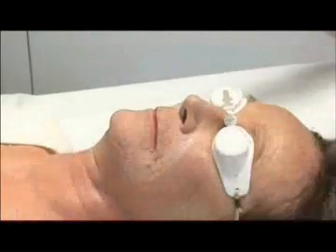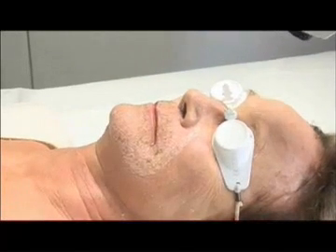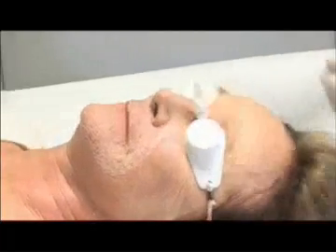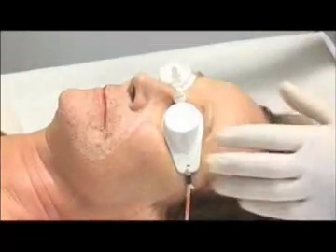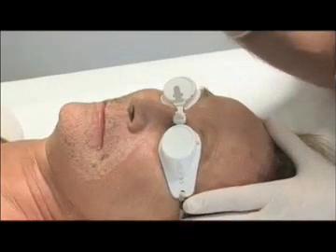Voilà. Now the skin is slightly thinner, we will therefore slightly decrease the intensity of the energy. It was at 300 millijoules, and we will go down to 225. We will continue to go over the entire face in this way.